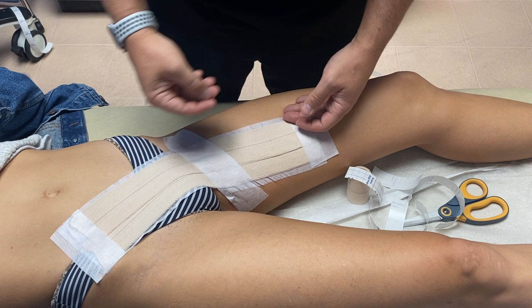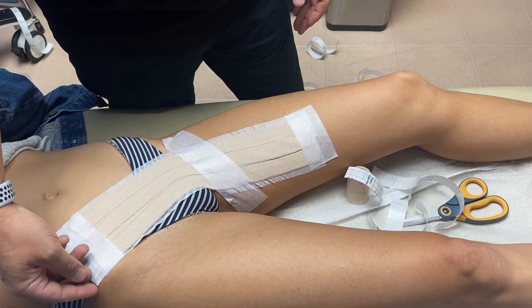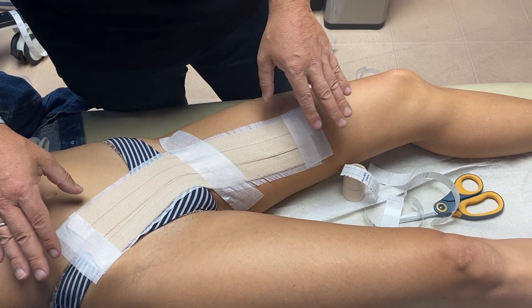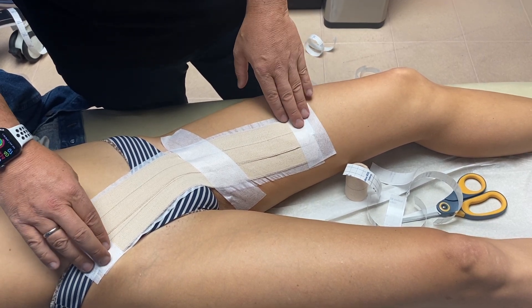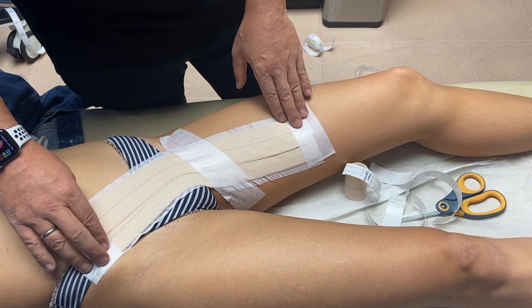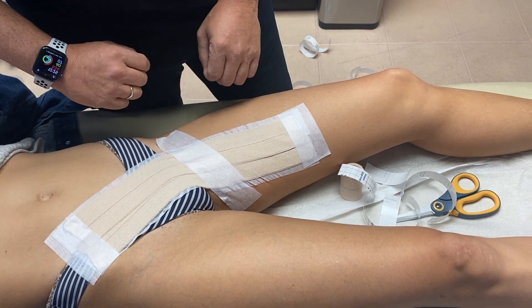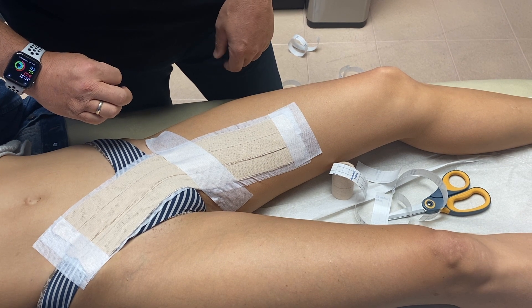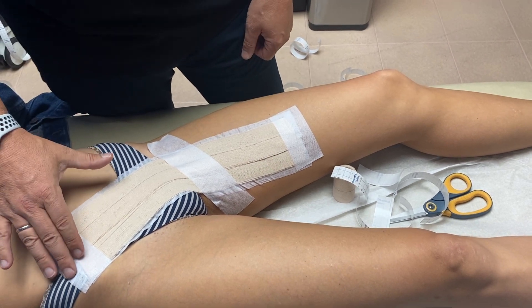Just to note: this tape is going to come right over the top of the pubis, or right above the base of the penis for men. The same taping technique is used for both men and women. That's the athletic supportive taping for adductor longus tears — especially important after regenerative medicine treatment to the adductor longus.